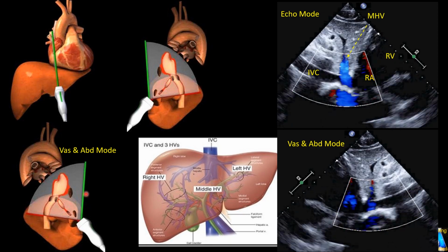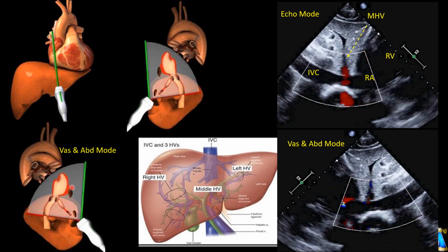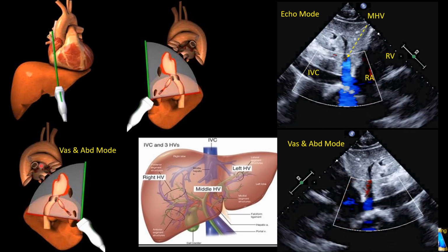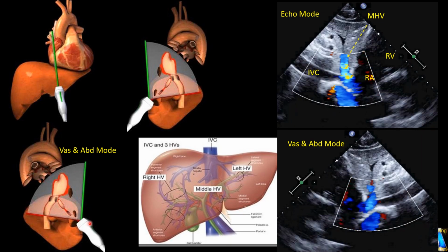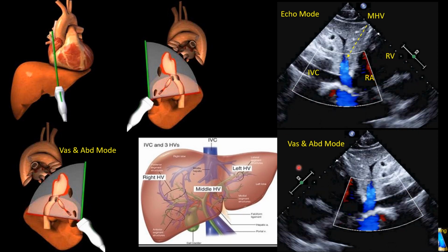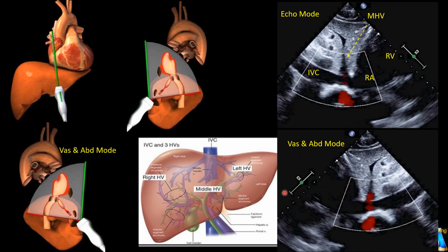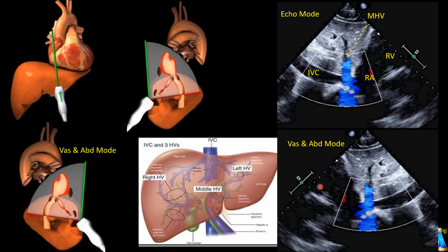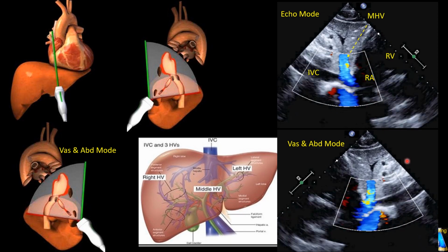In the vascular and abdomen mode that they use in the abdomen or vascular study, the cross-section surface looks like we are cutting it and watching from the right side of the patient to the left, and the machine twists it counterclockwise and flaps it up, and finally it gives us this image. As you can see here on the abdomen and vascular study, here will be the cephalic part because the marker is on the left side. Here is cephalic, and here is caudal, and anterior and posterior the same way.